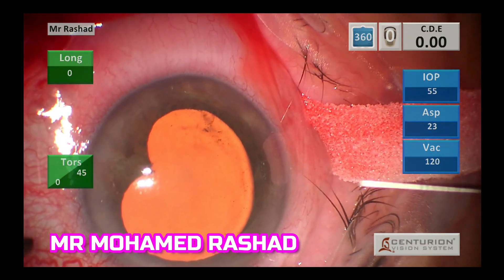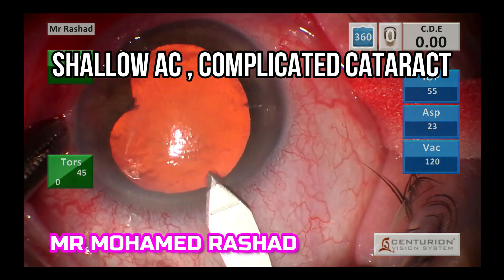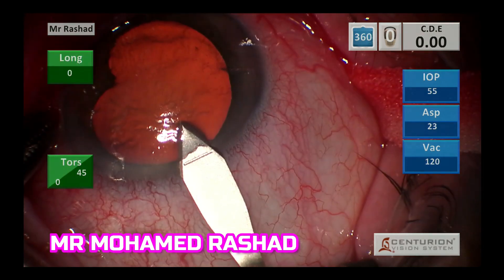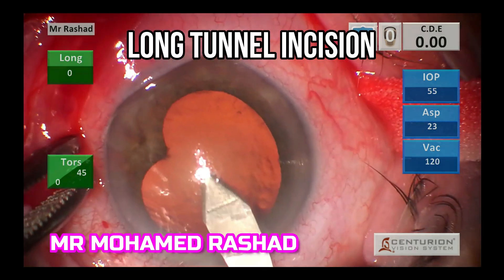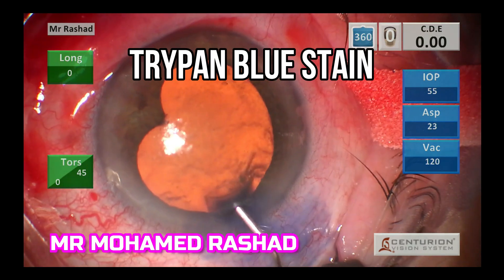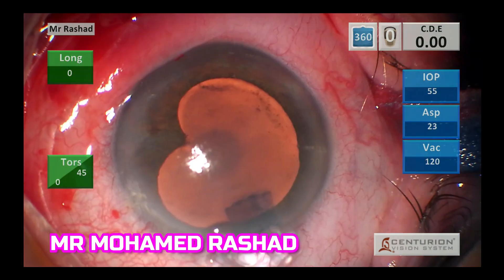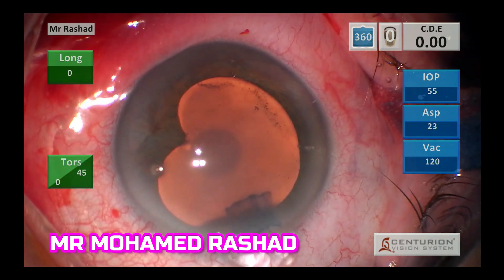The AC is shallow in this case, so I decided to do a long tunnel, two-step tunnel, and injecting trypan blue stain with high viscous OVD Helon GV.